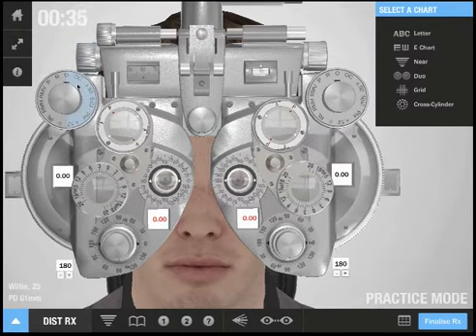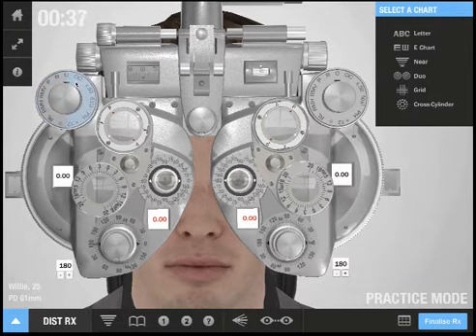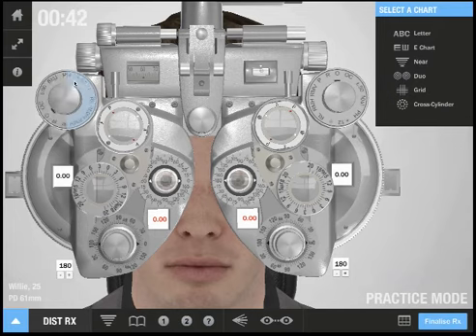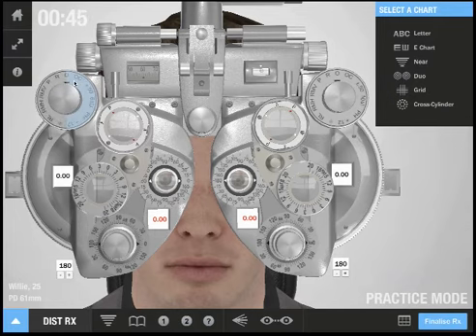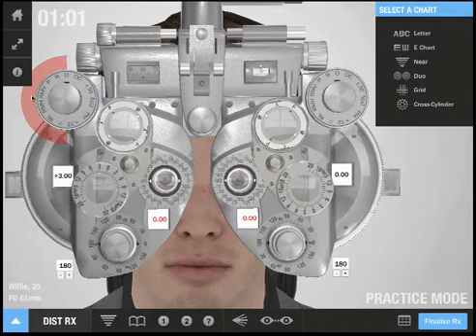This is the aperture wheel. I can turn it by clicking on either side of this. Here I can adjust the spherical power in large steps.